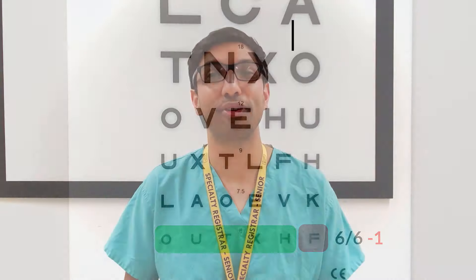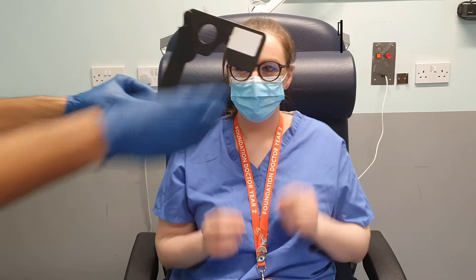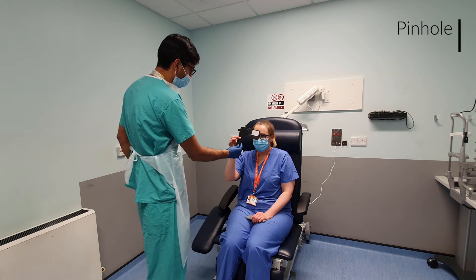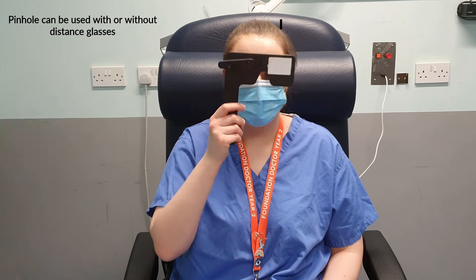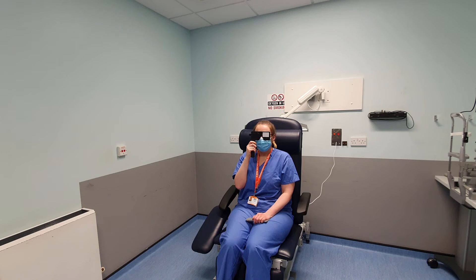Then repeat this process with the patient's distance glasses prescription if they have it. The next step is to use the pinhole occluder and ask the patient to try to read further down if they're unable to reach the 6/6 line. The pinhole occluder can correct refractive error and essentially provides the visual acuity with a corrected glasses prescription. This can be helpful if the patient has forgotten their distance glasses, and will help you determine if a lower-than-expected visual acuity may be due to refractive rather than a pathological cause.